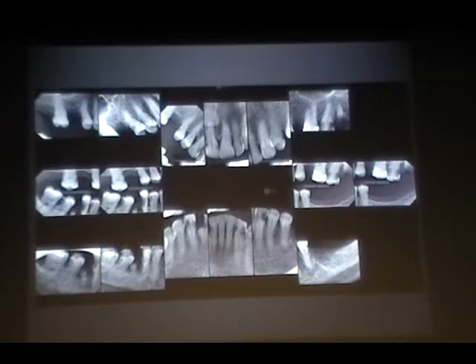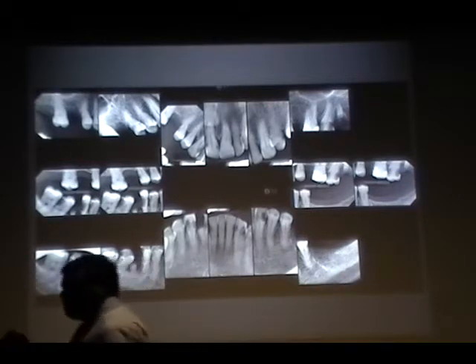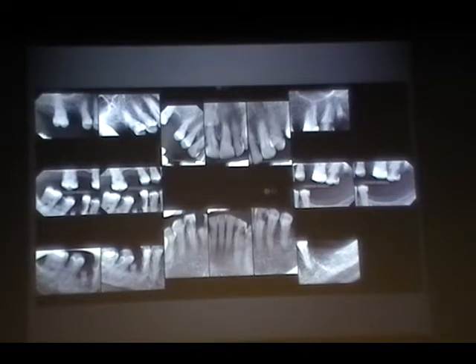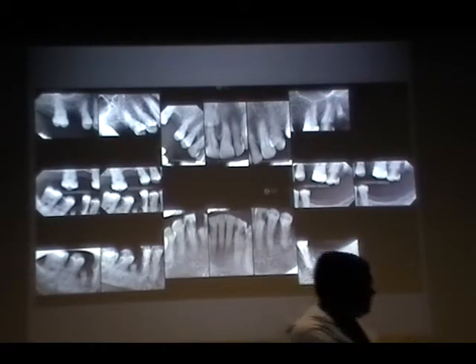So one, we did capture the distal canine a little bit, but there's still a little overlap. The overlap that you're seeing is only with the enamel. That's acceptable. If it's more than that, it's not acceptable. Make sense? Because enamel you can see through and through, if there is a dental caries or not. If it's with dental overlap, it's not ideal.